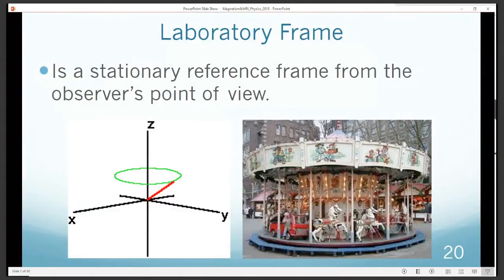To really describe this, we need to try to come up with a more simplified point of view. Because if we're just looking at the magnetic moment of, say, all the water nuclei within a single voxel within a patient, it's going to be precessing at the Larmor frequency, which is many megahertz, millions of cycles per second.